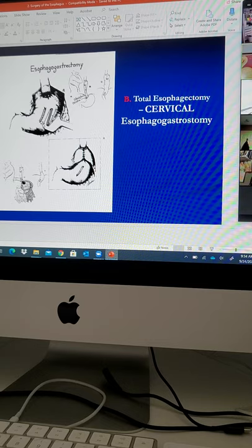So this is a TA device, okay? The TA device, you have them on the campus, and they have cartridges here. The cartridge with the staples is reloadable, and every one of them is a different color by the size and by how many times you can load it.